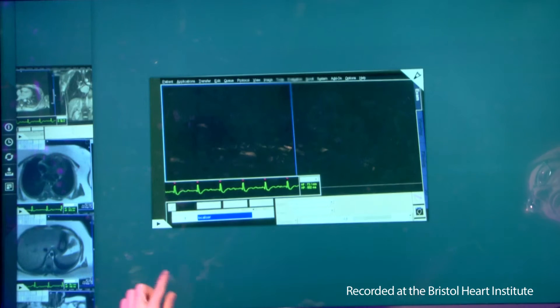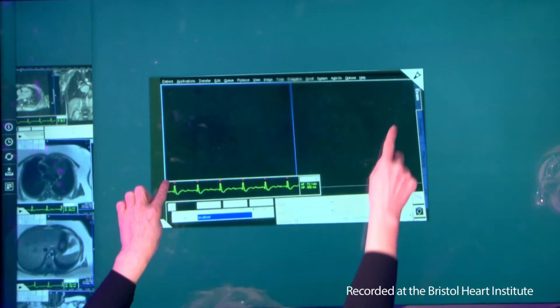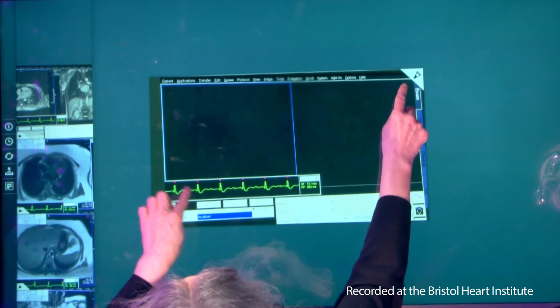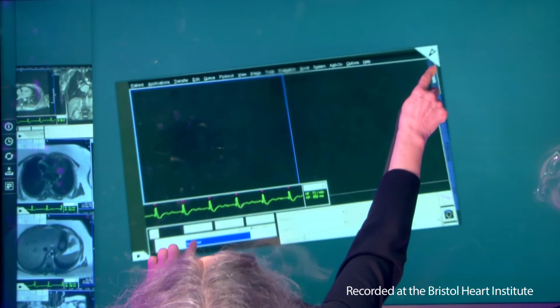Once you have your patient in the scanner on the table, how do you get started with the actual scan? To be honest, there's no chance to decide on yourself. If you put the patient in a scanner, then at first you will get images like this.